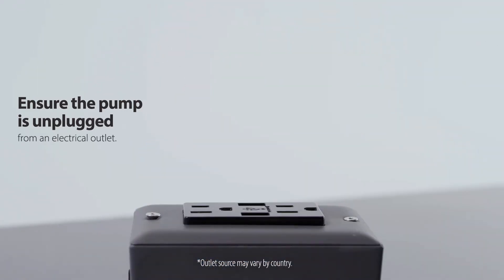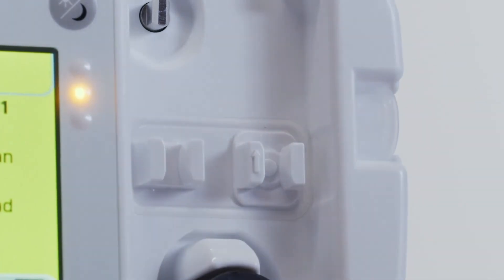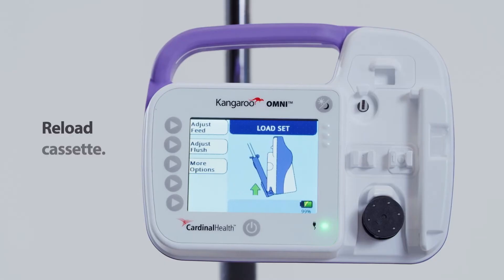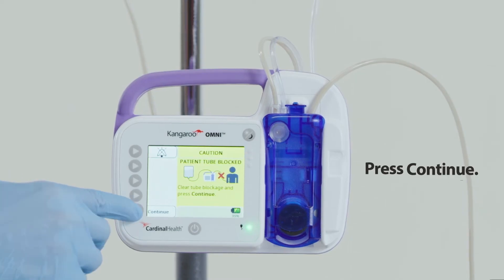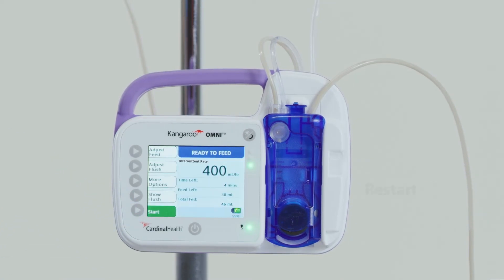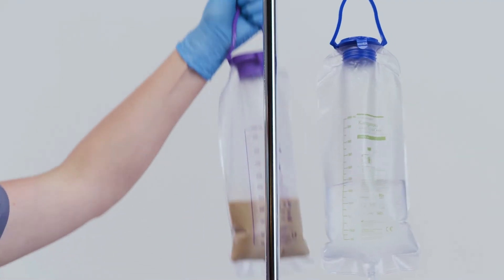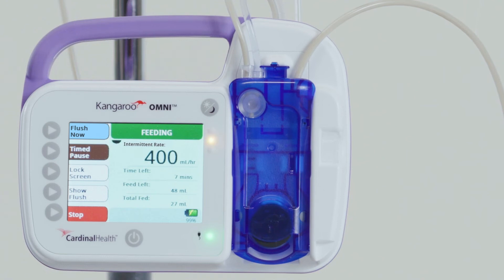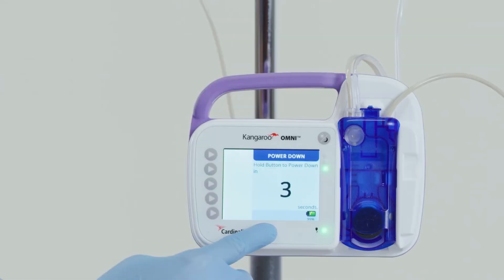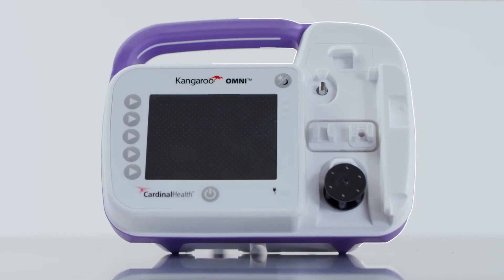First, ensure the pump is unplugged from an electrical outlet. Second, clean and dry the occlusion sensor region. Third, reload the cassette. Fourth, press continue. Fifth, restart feeding. If the alarm continues, replace the feeding set. If the alarm continues after replacing the feeding set, press power off and use a different Kangaroo Omni enteral feeding pump.